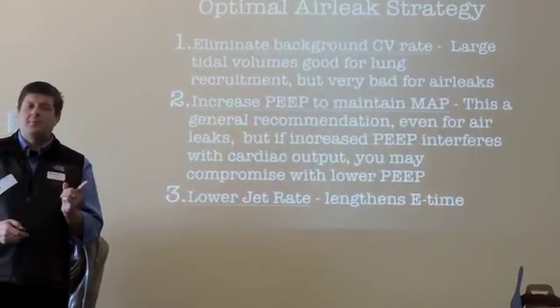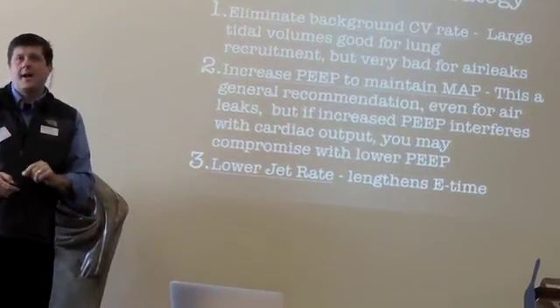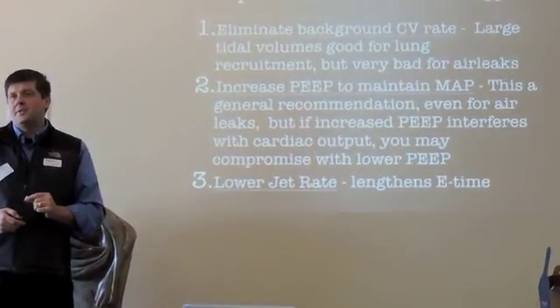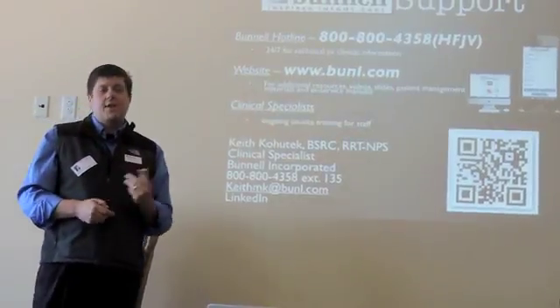Remember, the large volumes aggravate the air leaks, so we want CPAP. But that also means we may have to have higher mean airway pressure and higher PEEP to maintain our mean airway pressure there, and then lower the jet rate.